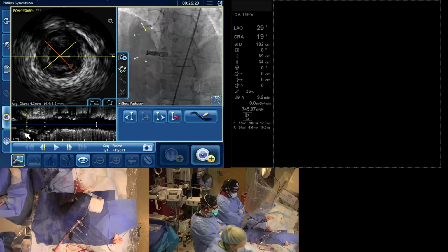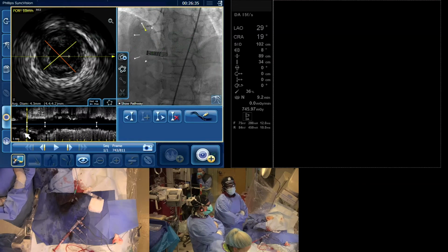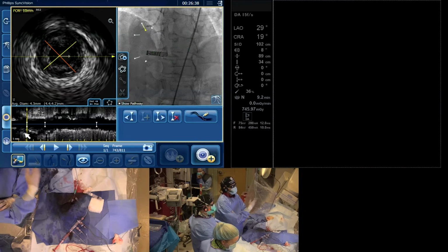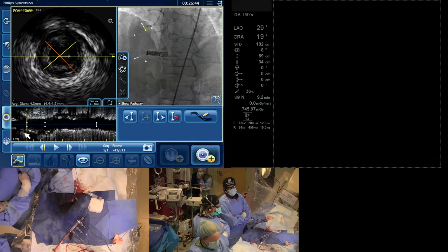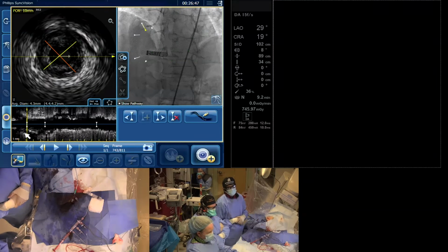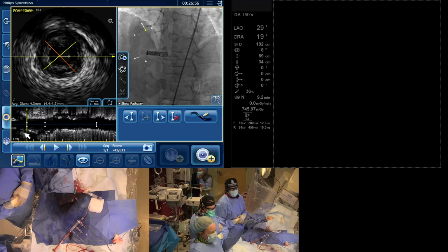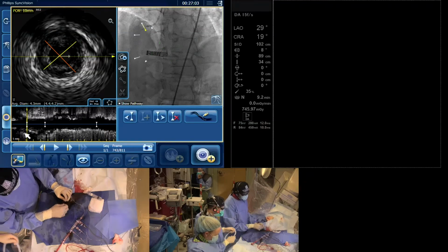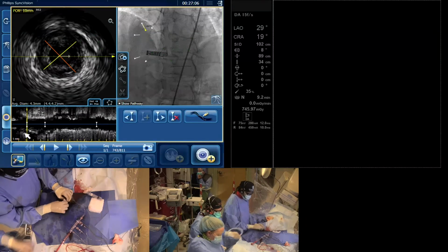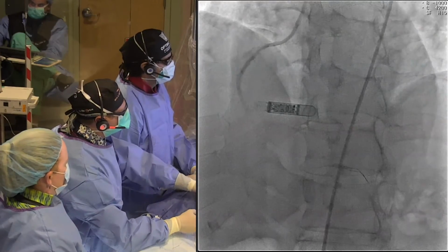Sure. So, based on the different frequencies of the IVUS, the current data suggests that 20 megahertz IVUS oversizes between 8 to 10%. So if we do the mean of this, which is 4.3, and discount it by 10%, that's 0.43, so into 3.9. Then we round down to our closest stent size, which is 3.5. So we're going to put a 3.5 proximally. Then we'll post-dilate the whole thing with a 3.5. Of course, at the end, we have physiology, so we're looking for an iFR greater than 0.89, at least 0.95. Whatever, we'll find out. We'll find out, yeah. So I think if we get to an iFR in the 0.95 area, I'd be very happy.